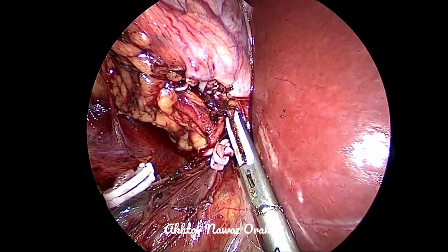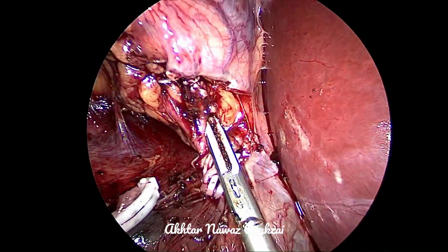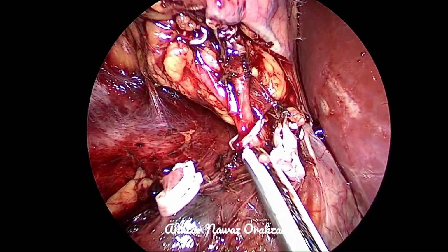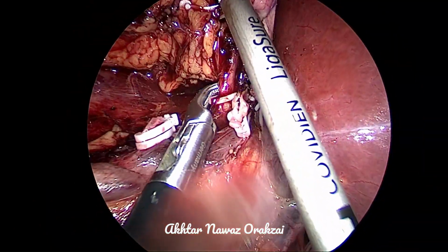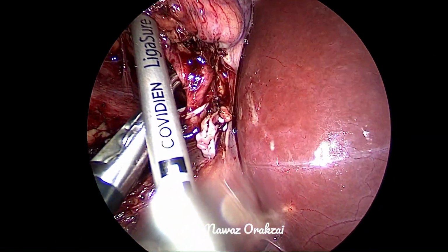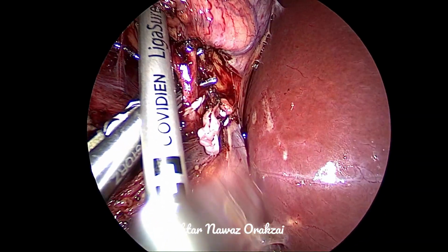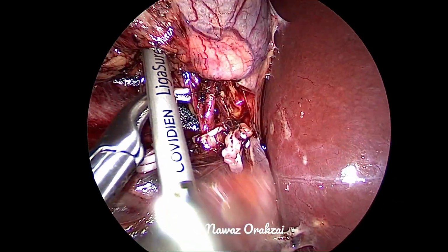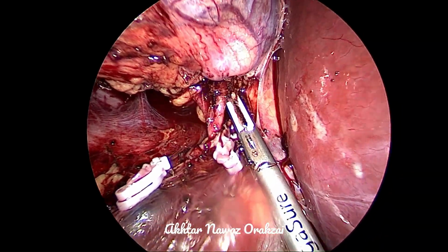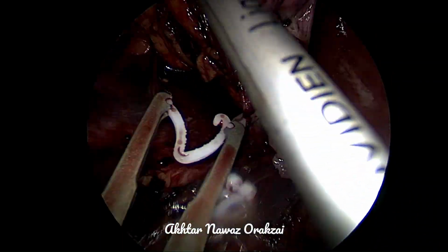This stretching can at times be an overstretching, and then if we cut near to the proximal clips, this may lead to slippage of the vessel from the clip or the clip from the vessel. So we divide the vessel near to the distal Hem-o-lok clips rather than the proximal Hem-o-lok clips.